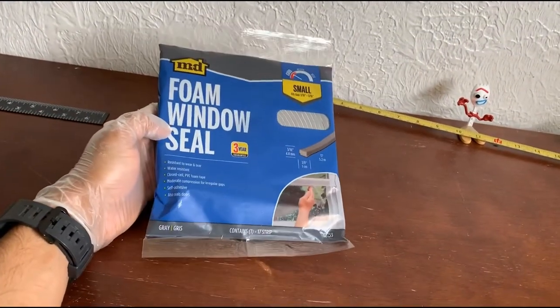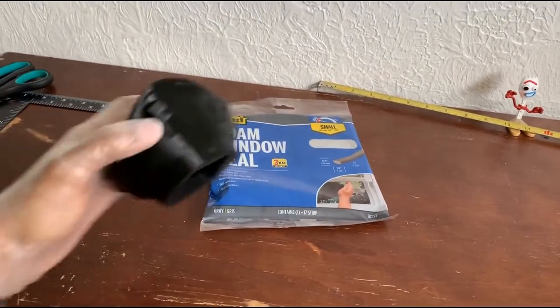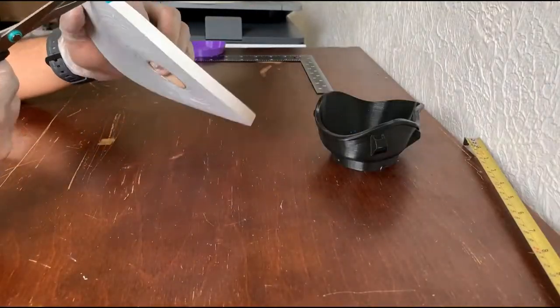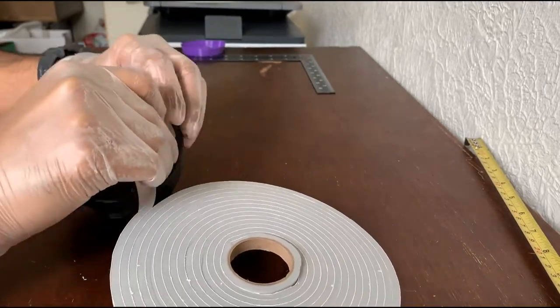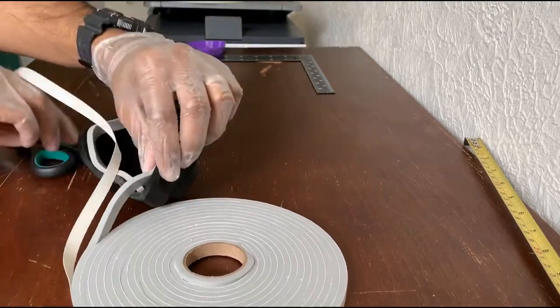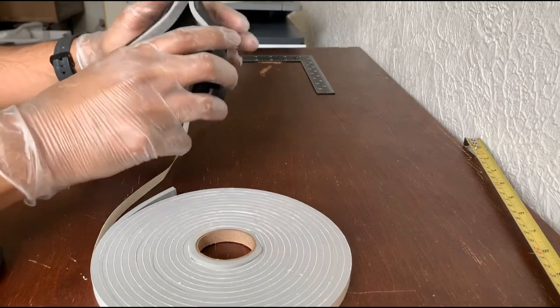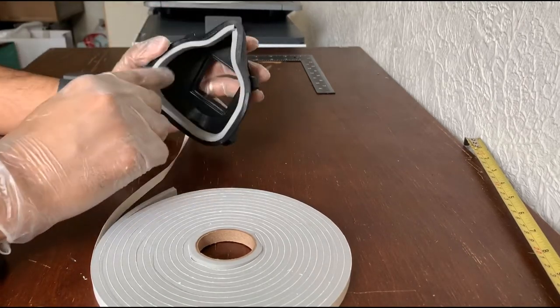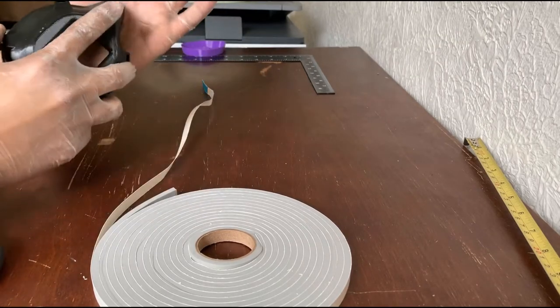I'll be using this foam window seal material in order to seal the edges of this mask, so we have a nice feel around it and it can fit around the face more comfortably.